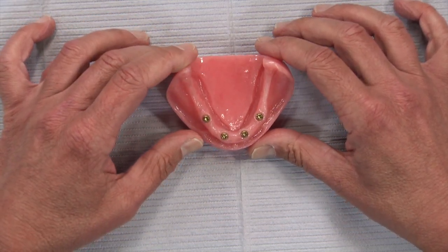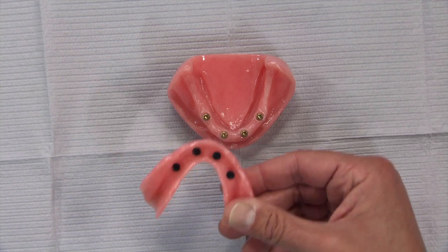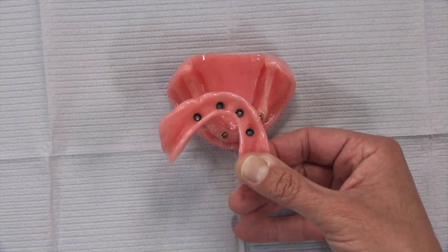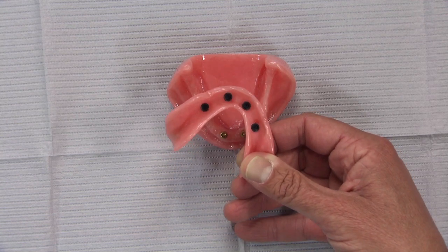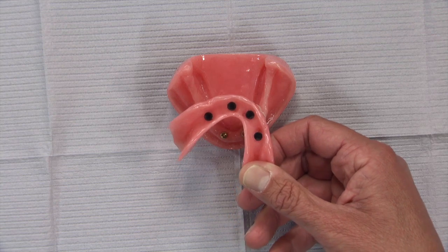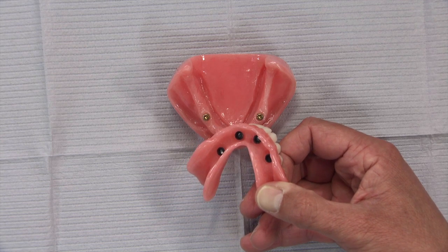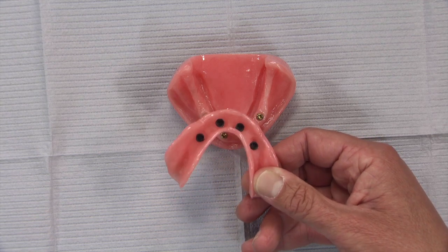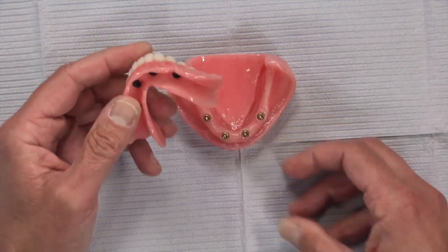You can see the locator rings on the inside — these are the black processing caps that won't actually be used once everything is done. There are a few different retention strengths to choose from; three ship with the case: a clear one at five pounds of retention, a pink one at about three pounds, and a blue one at 1.5 pounds. I start most patients with the blue one — Zest calls it extra light retention — and most are happy with it. We can move up to the pink if needed, but patients don't want to break nails trying to remove the denture.